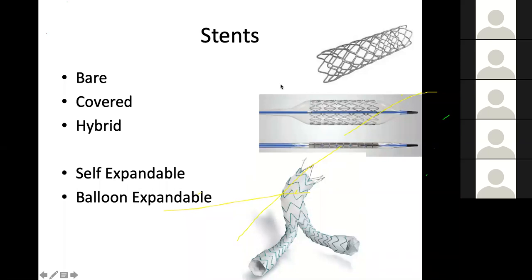Yeah. So as far as biliary stents are concerned, we use self-expandable stents so that they can cause some pressure on the tumor which is trying to ingrow. So we use self-expandable stents in PTBD. As far as the procedure is concerned, yes, for procedures we can have another class, certainly.